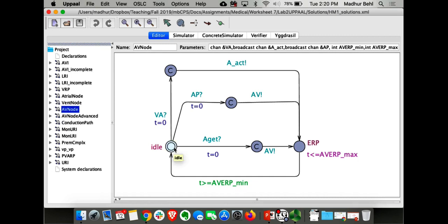This is not the path, remember. This is the AV node. The job of the AV node is twofold. It's to add a delay and to slow down the conduction. And in this case, the AV node is preventing this back propagation, or, you can see visually, we have added an explicit ERP state just in the AV node. So you can actually think of your heart as, in Uppaal, it's both the SA node and AV node together which are preventing this ERP depolarization problem, where we want that if the heart or the atria is in ERP, then you shouldn't accept a depolarization signal.